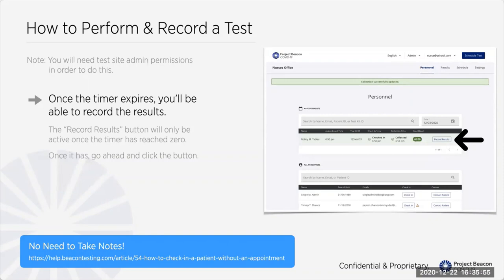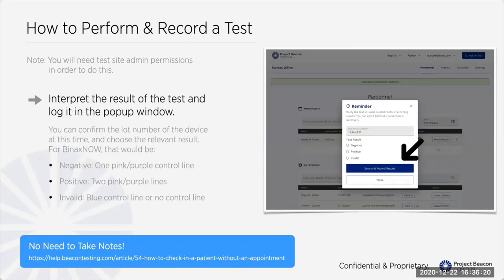Once the timer counts down to zero, the row for that patient turns green so you notice it in the table, and there's a new button that says 'record results.' We don't show the record results button until the 15 minutes have passed, to make sure you've waited long enough for results to become apparent. Once ready, you interpret the test results and record them here. We'll verify the lot number — it should be pre-filled. You choose the result: positive, negative, or invalid. On the BinaxNOW, negatives are one pink-purple line and positives are two pink-purple lines; no control line or a blue control line means invalid.